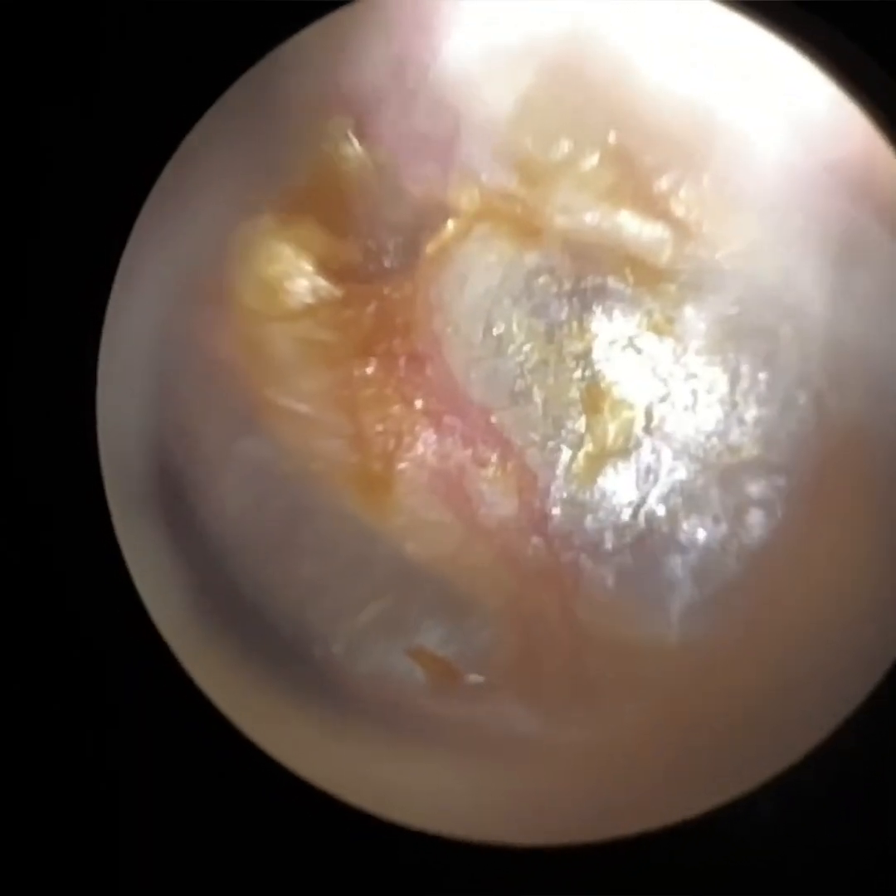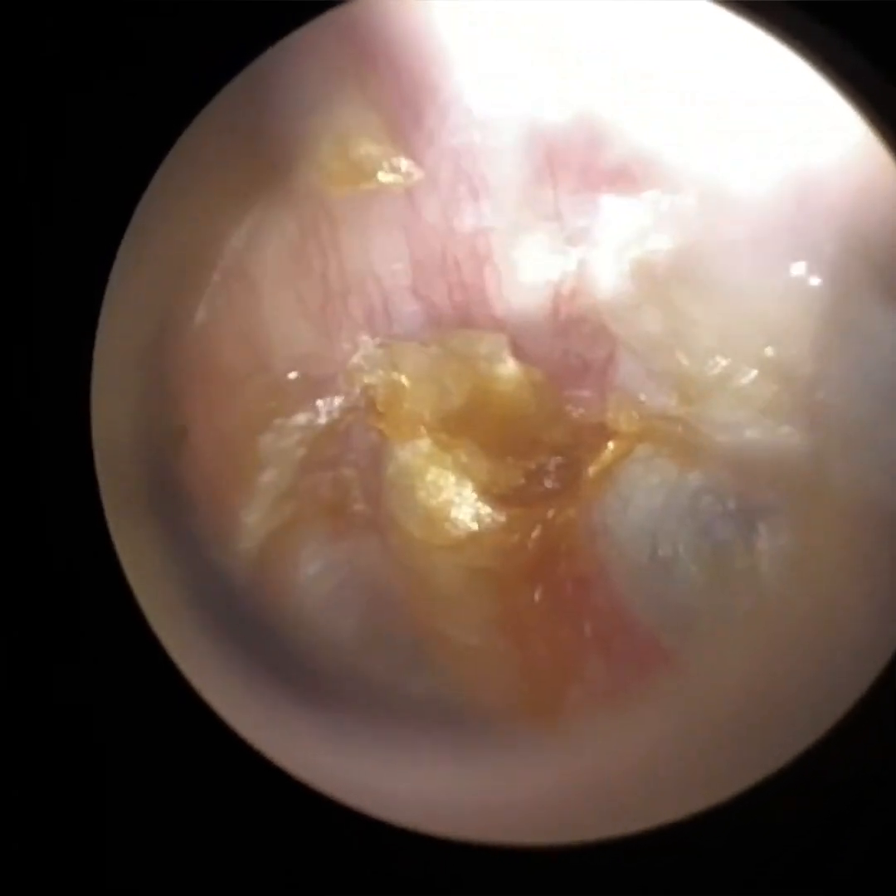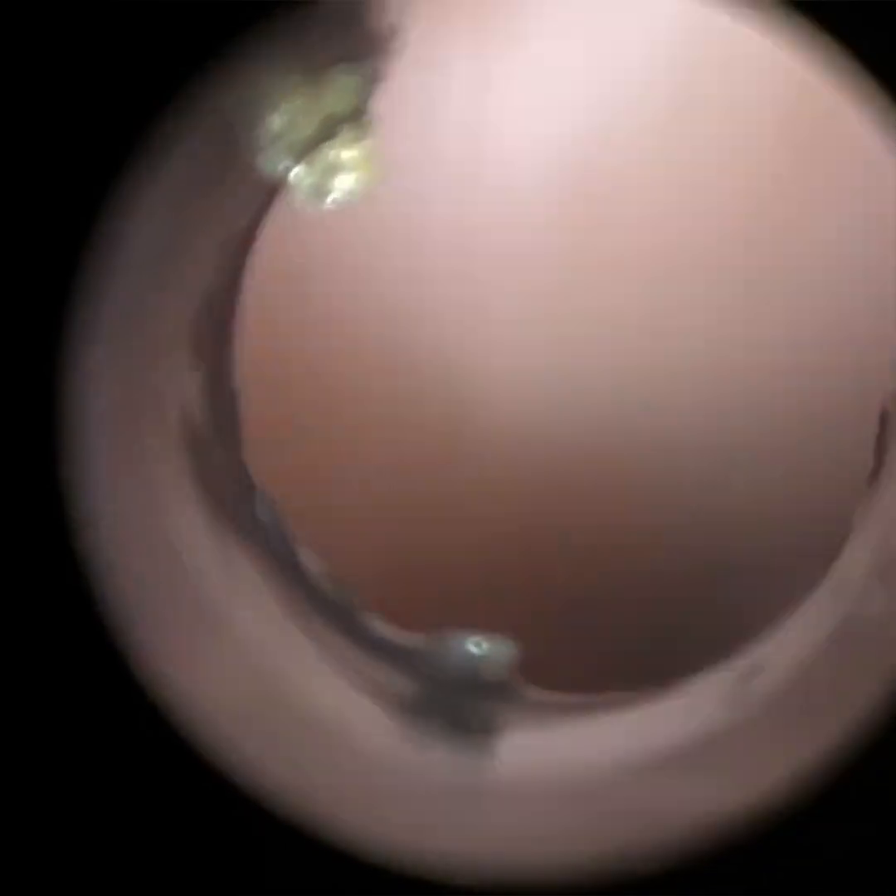However, the beauty with the Waxcope is that you don't have to constantly reposition yourself or the patient. Instead, you just adjust focus by double-tapping the screen — we have an autofocus feature, which is pretty accurate — or you use the focus slider on the app. Ergonomically, the Waxcope is far superior. Its benefits over headworn loops and microscopes are the magnification, focal depth, and depth of view — you can see far deeper in the ear. Its benefits over an ENT operating microscope are cost and portability. For the sole purpose of removing earwax, it's the next best alternative to the endoscope.